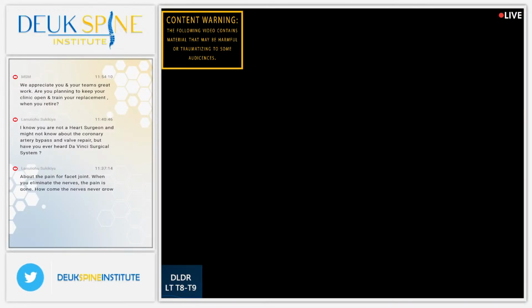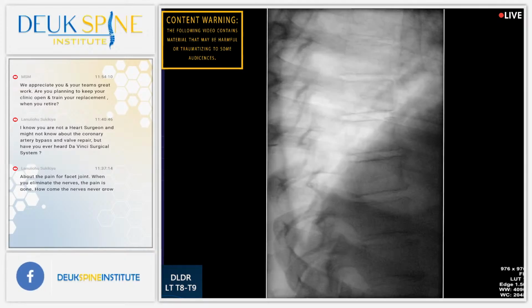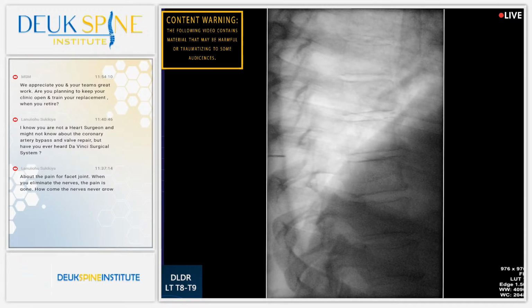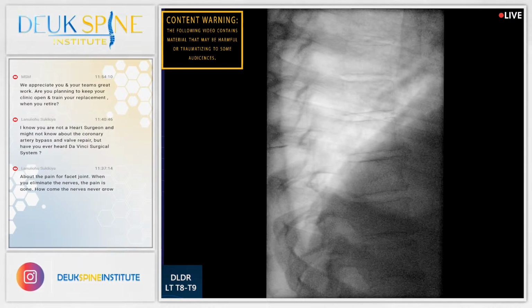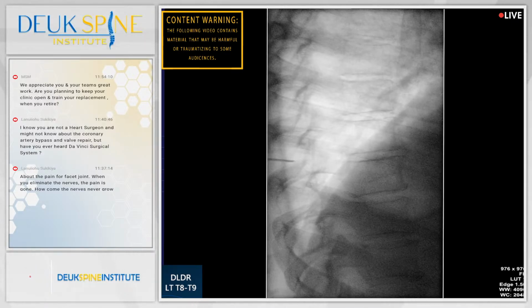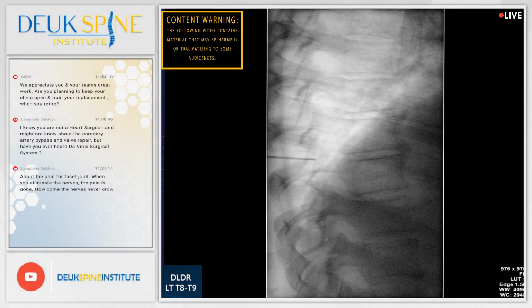Shot. In that same bone again. There's just no way around it.